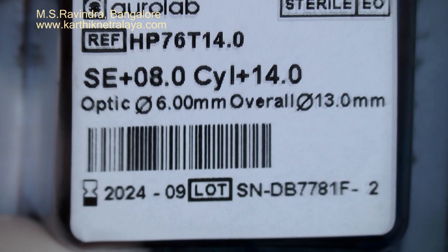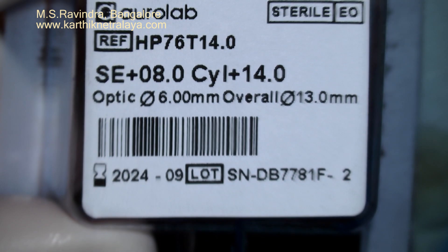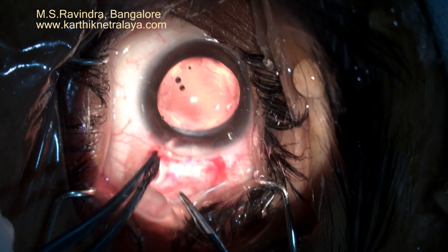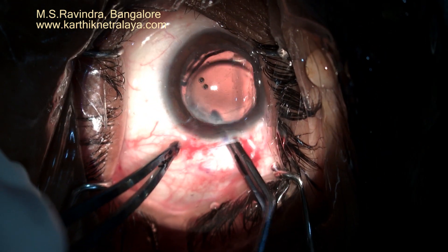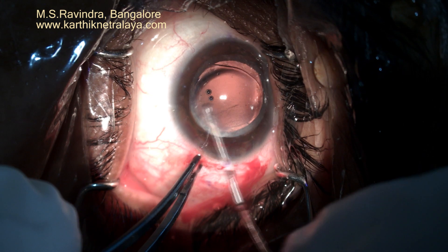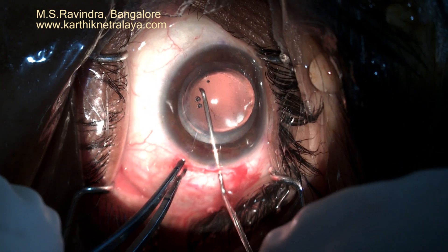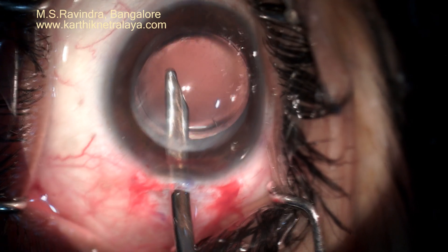A lens of 14-diopter cylindrical power is implanted. This is a hydrophobic lens of very high cylindrical power, manufactured for this patient on a custom basis. The lens is placed so that the axis marks on the eye coincide with the marks made on the cornea or the limbus.